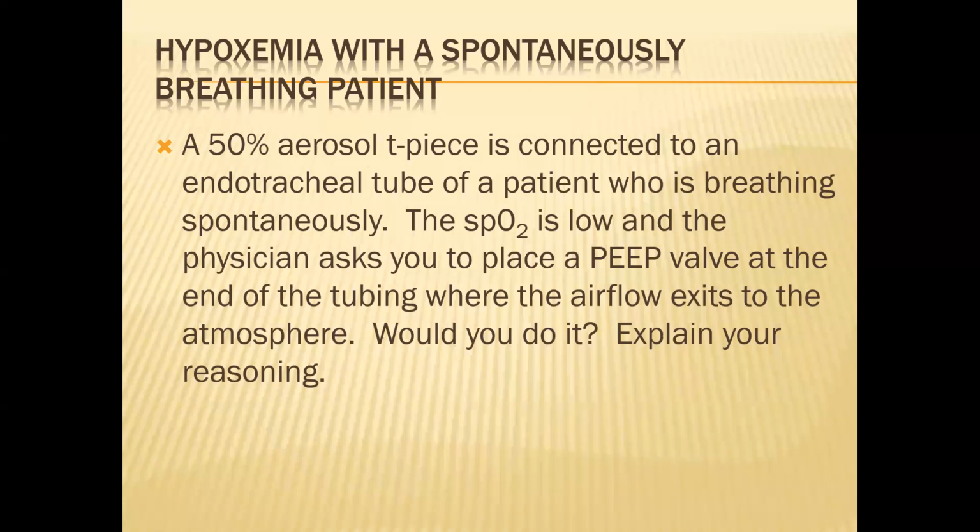That's the whole point. Yes, that's the answer. Sometimes I just share experiences that I've had. So a doctor asked me, well, 50% is not doing it. How about if, can't you just stick a valve on the end of it and give some PEEP to the patient? It's like, no, you can't have any obstruction to flow because they're not going to be able to get fresh air flowing.